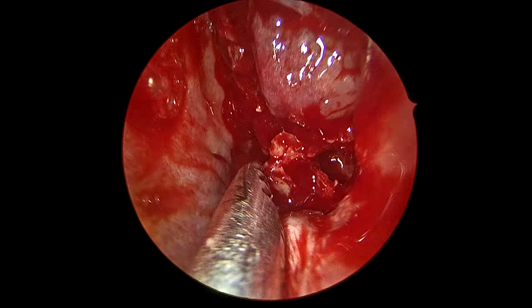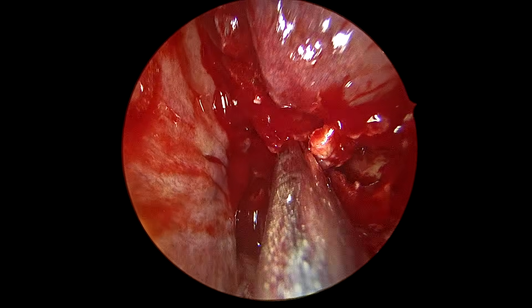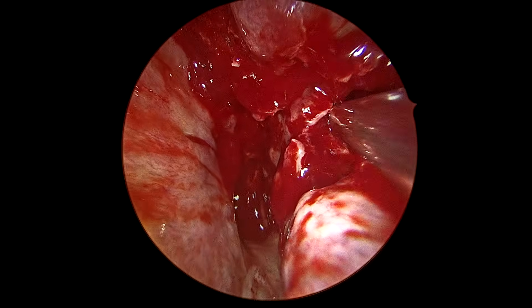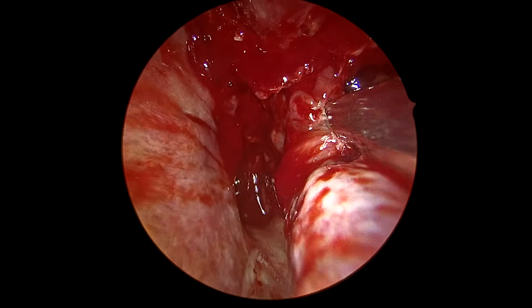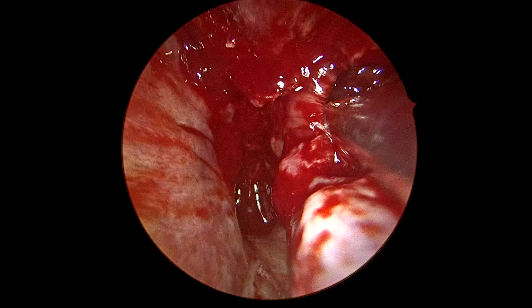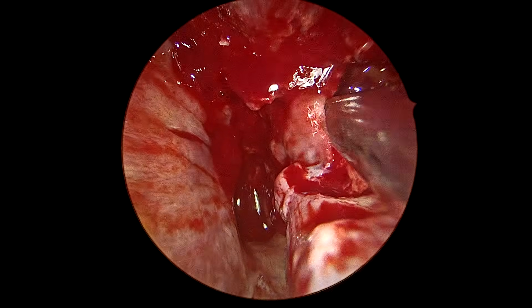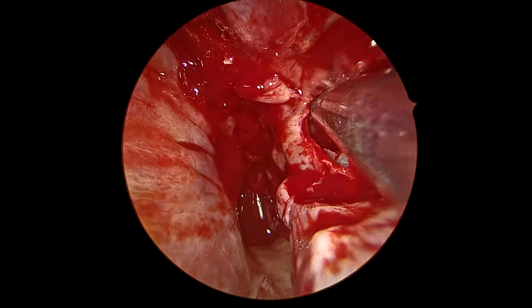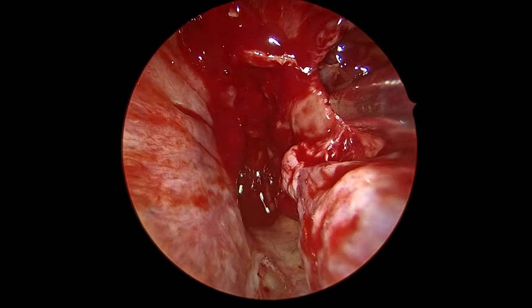This is the mass basically. Now we have to see the attachments and debride the attachments so that the chances of recurrence are minimal. What I'm doing right now is widening of the maxillary sinus. This area is a lot thickened, so possibly could be the origin of this mass. Till now, I had no idea whether this mass is a polyp or a soft tissue tumor.